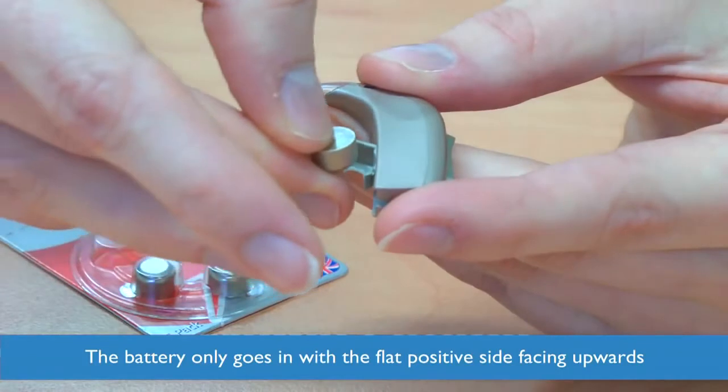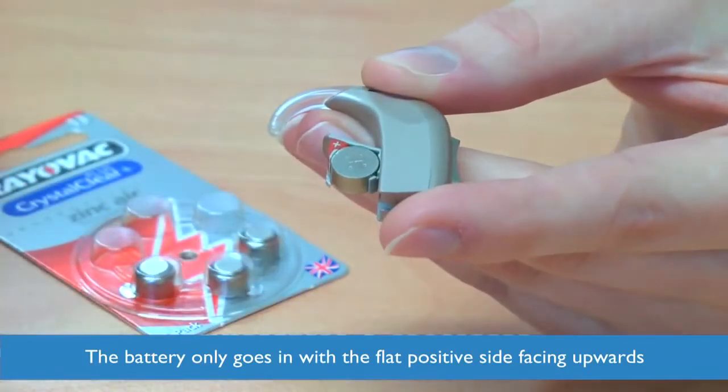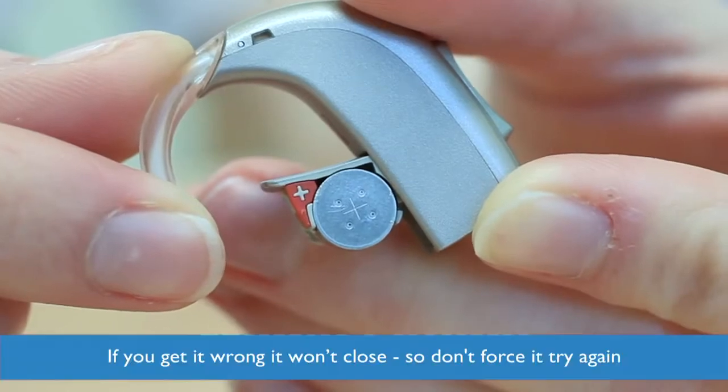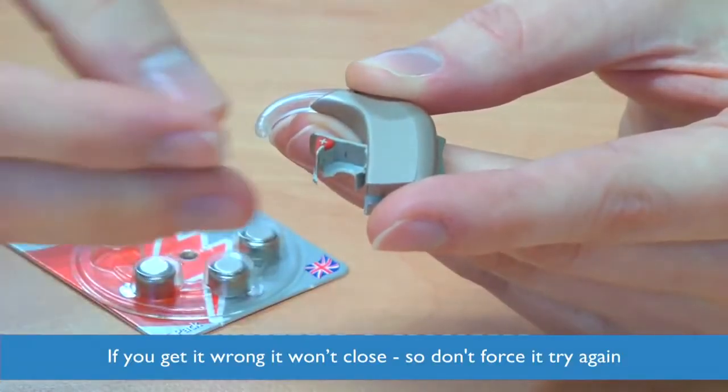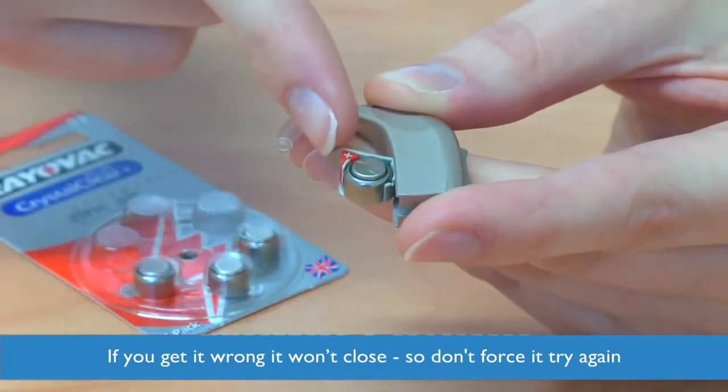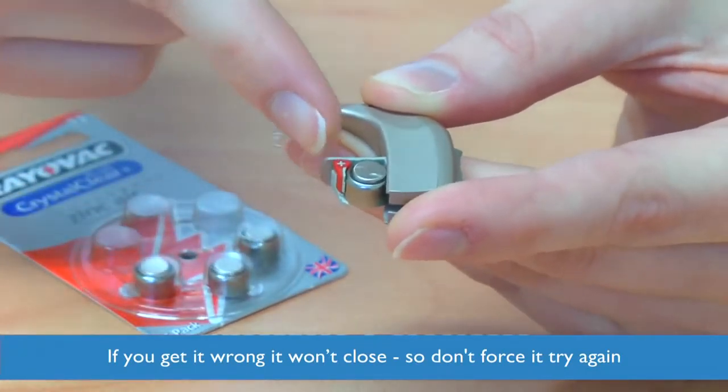The battery will only go in one way, so just make sure you get the flat, positive side facing upwards. If you get it wrong, it will be difficult to close, so don't force it, but turn it over and try again.